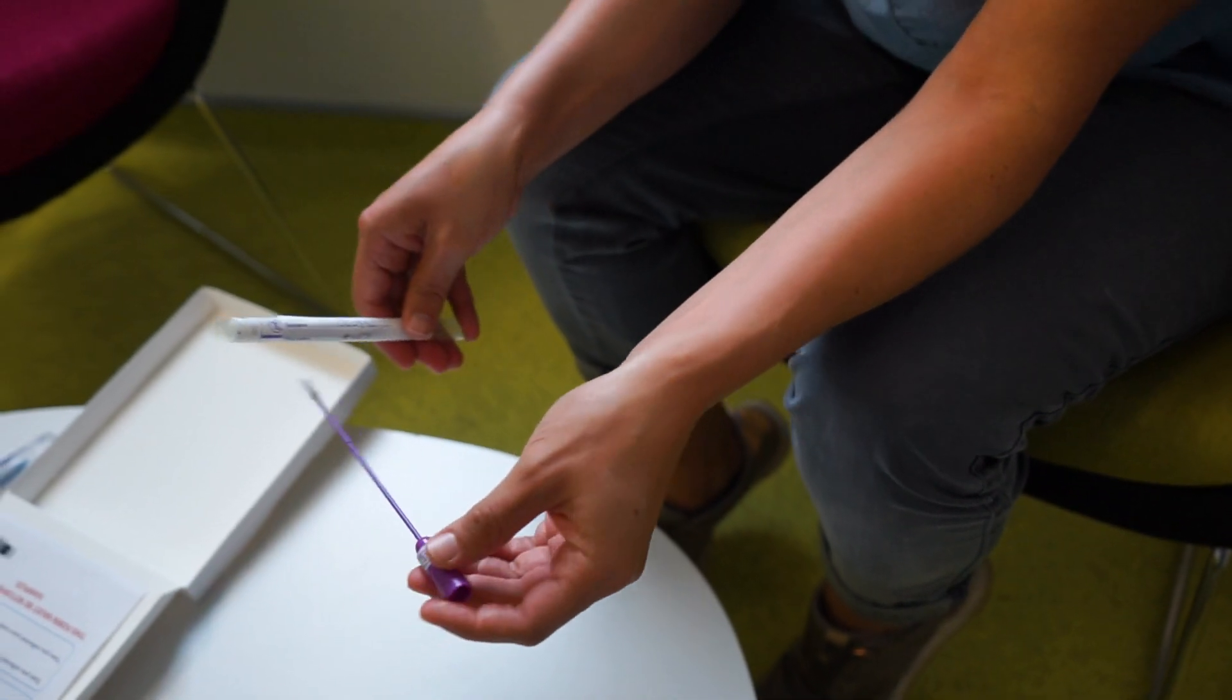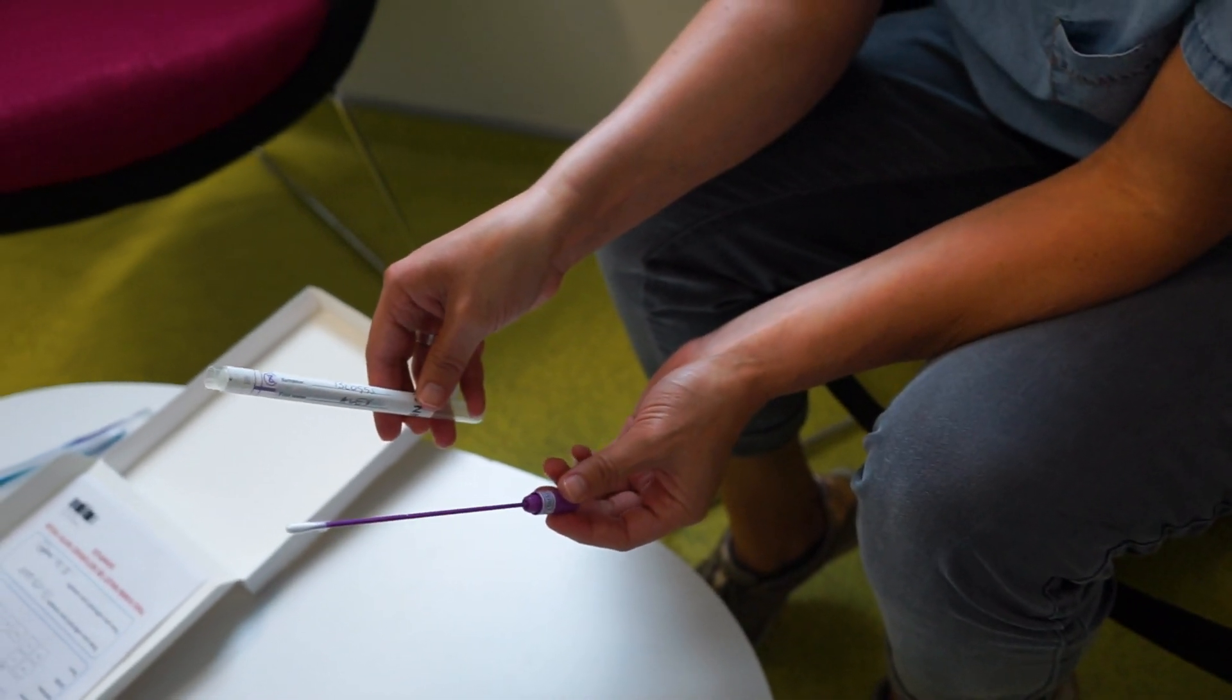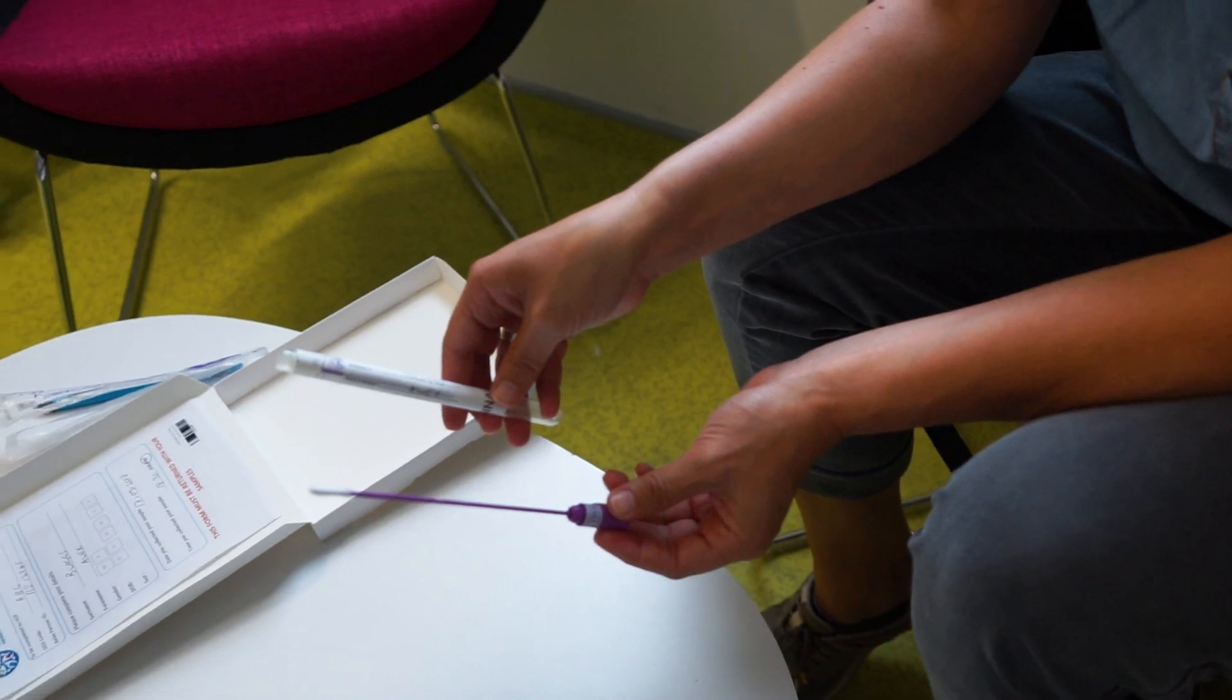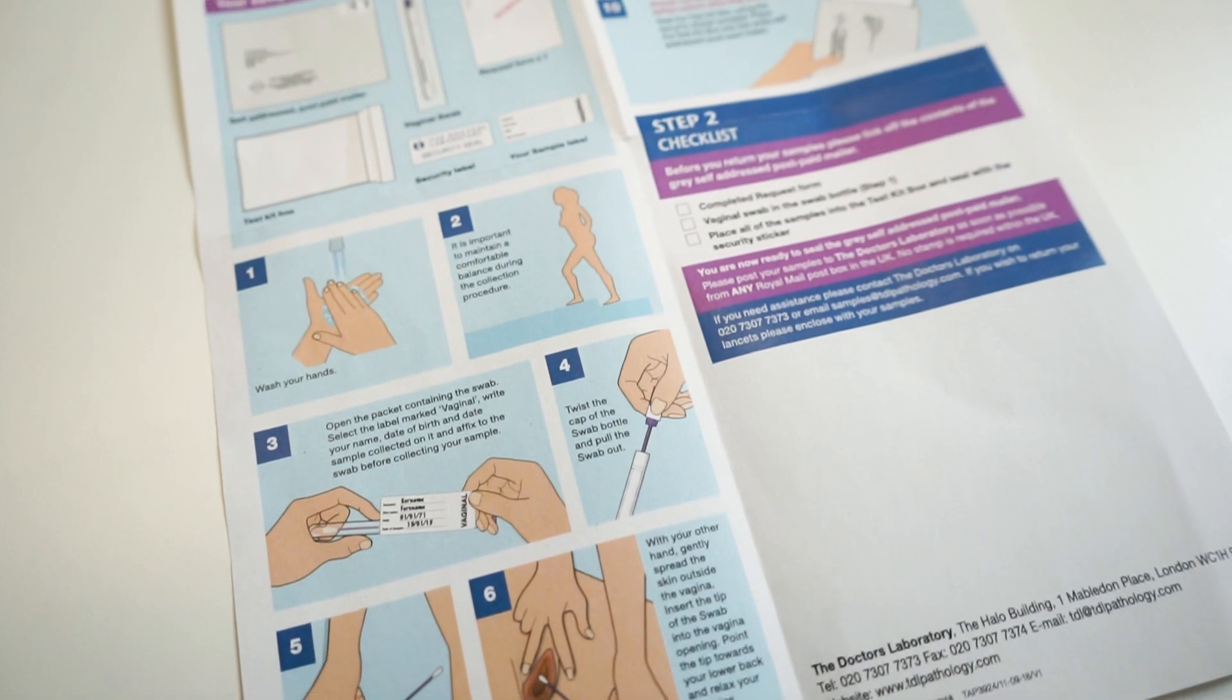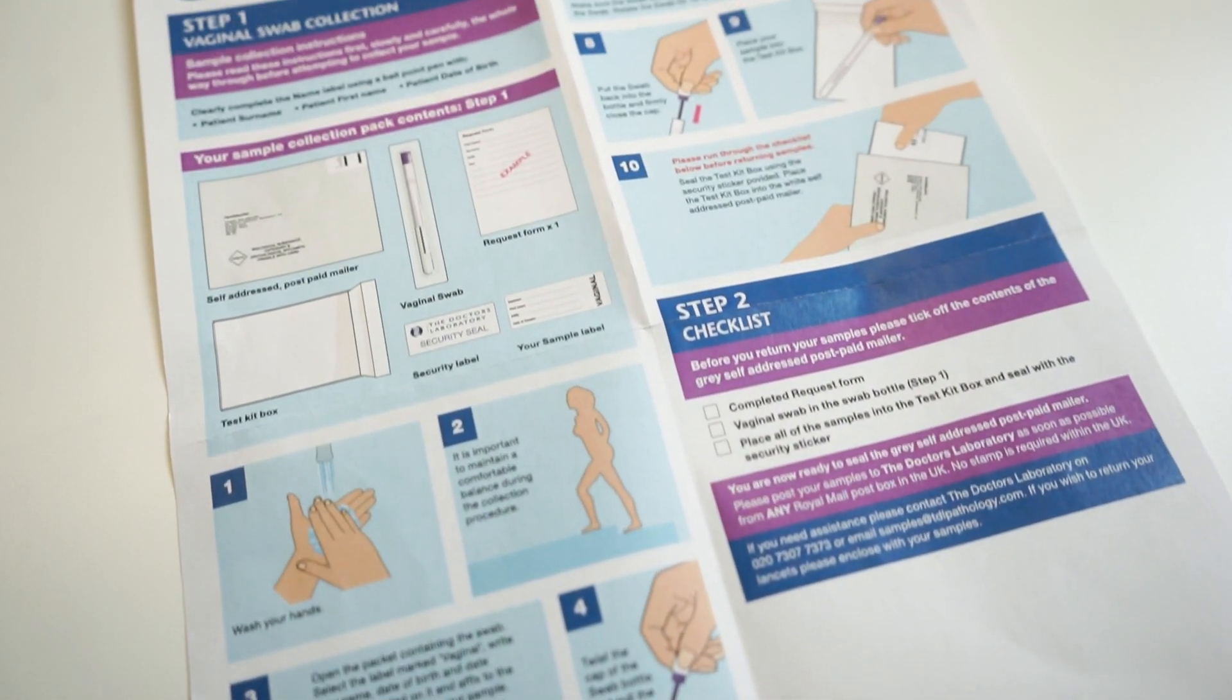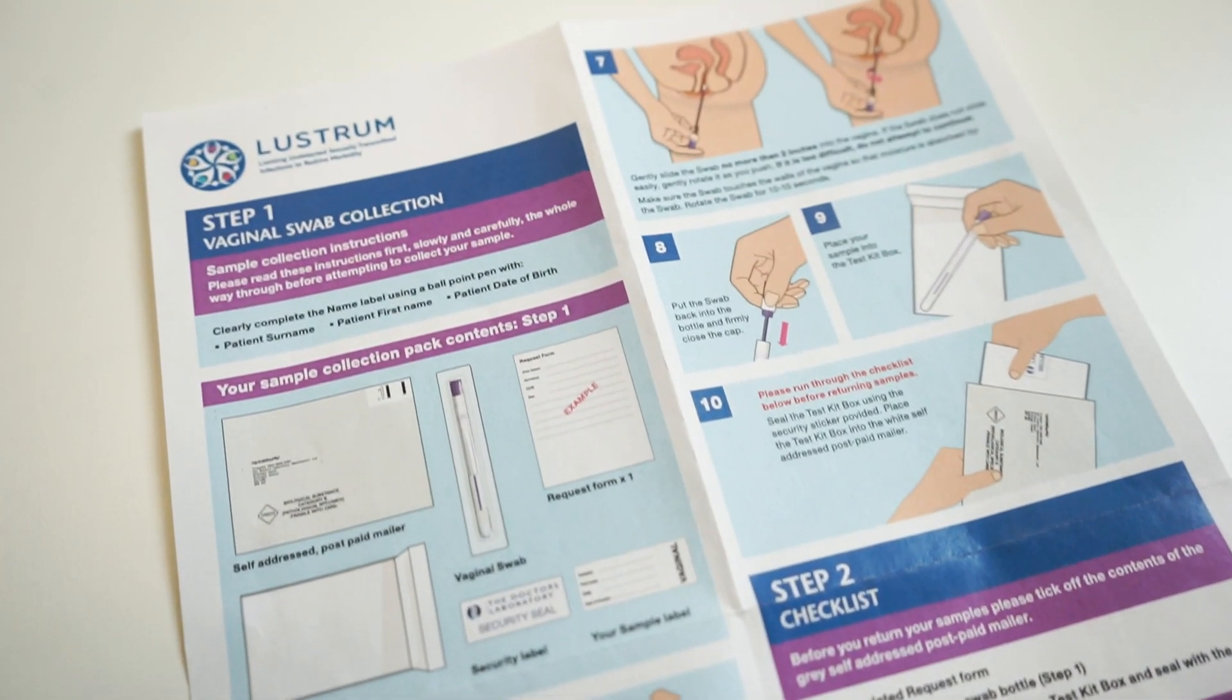With your other hand, gently spread the skin outside your vagina. Insert the tip of the swab into your vagina opening. Point the tip towards your lower back and relax your muscles. Gently slide the swab no more than two inches into your vagina.